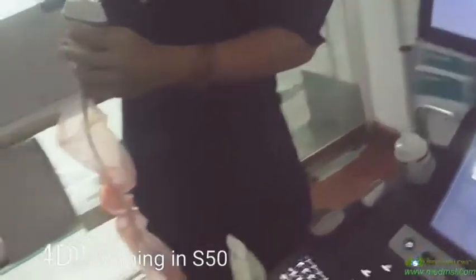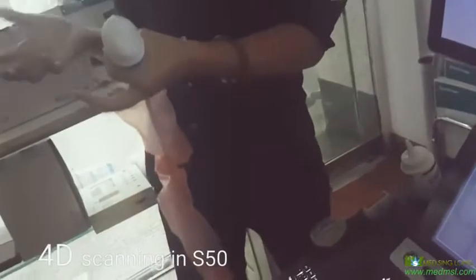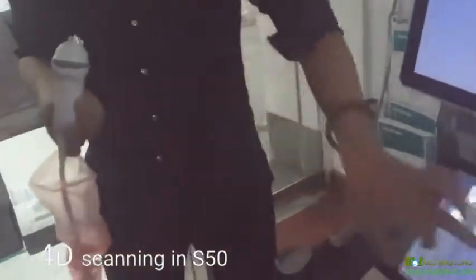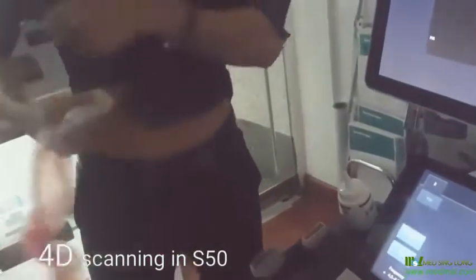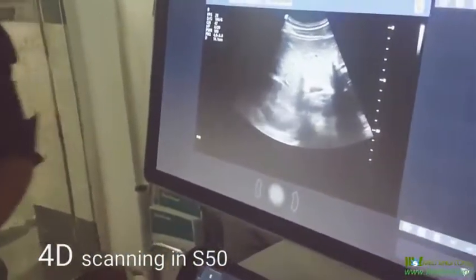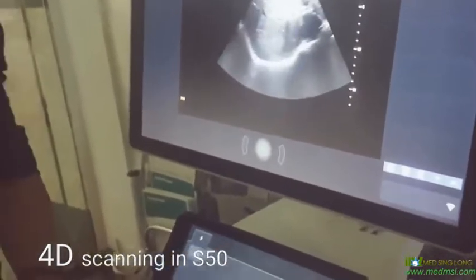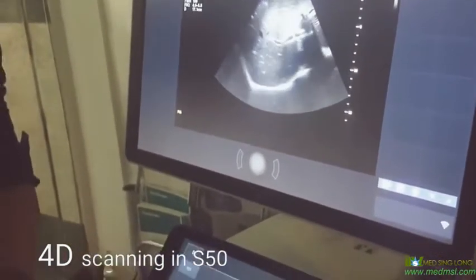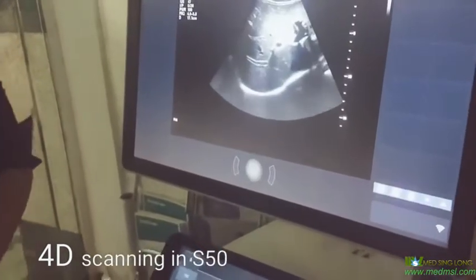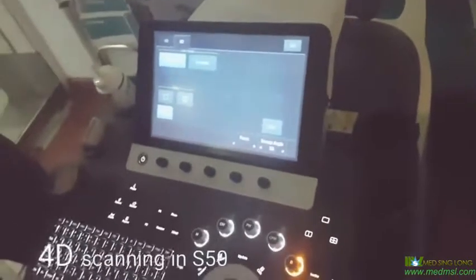Are you talking about 5D? 5D? I think it's something amazing — they just call it 5D, but it's not really 5D. Normally the doctor uses 4D to see the fetus. If we want to use 3D or 4D, we just scan the section of the baby and press here 3D or 4D, and we choose 3D or 4D here. 3D means just one static image and 4D means it's live.